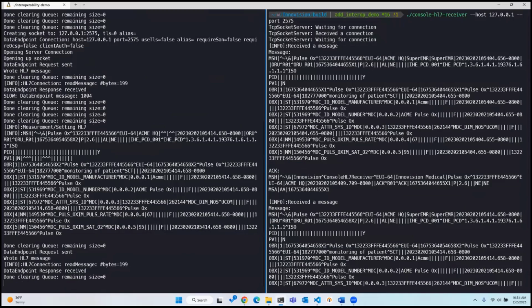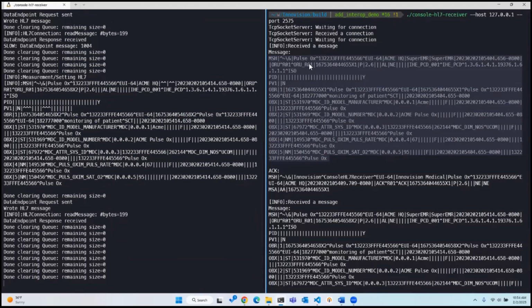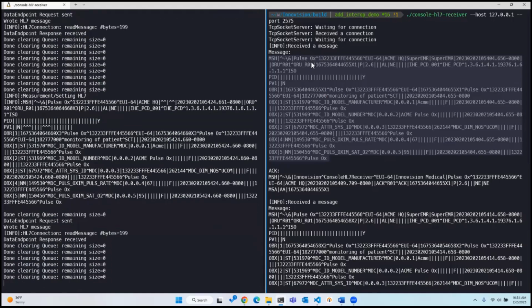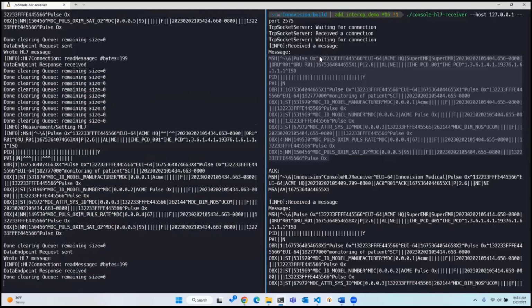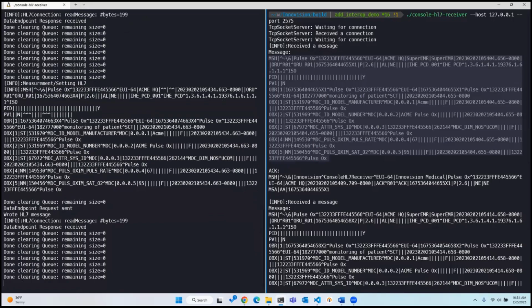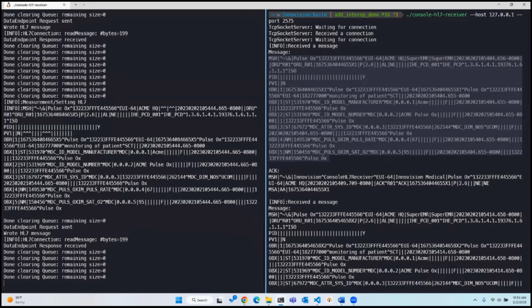So let's go over that. I'm going to go up here so it doesn't move. Here is our message that we received in the super EMR. And as you can see, right here, we're receiving the application. So we are the pulse ox. That's what we set in our device profile. This right here is the encoded version of our EUI64. Here is our sending facility, the Acme HQ. Here is our receiving application and our receiving facility, which are both the super EMR.